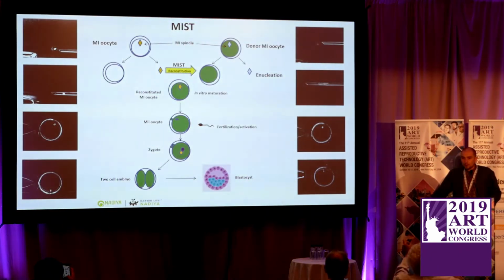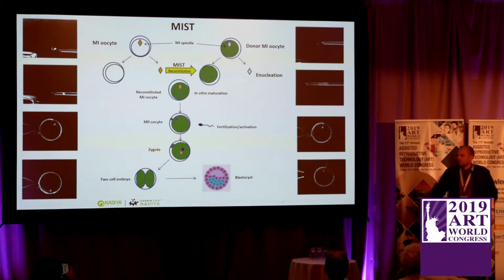And one more I will show. That's where I told you about the 39 year old patient who had aneuploid embryos, because that's her case, and that's very interesting here. After PNT, this type of nuclear transfer is my favorite, and I like it more and more with time. So I think that this type of nuclear transfer will be the future that I will focus on, because it works very well.